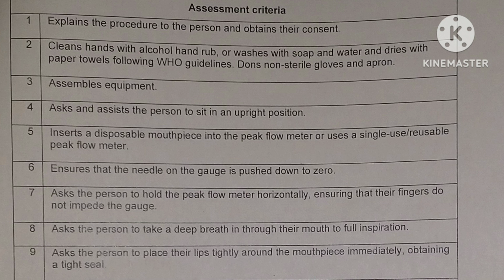Then we have to introduce ourselves. Hello, my name is. Then the purpose of the visit we have to explain. I'm here to explain to you how to perform a peak flow. Is that okay? We should get the consent from them. Then we should explain what is peak flow.